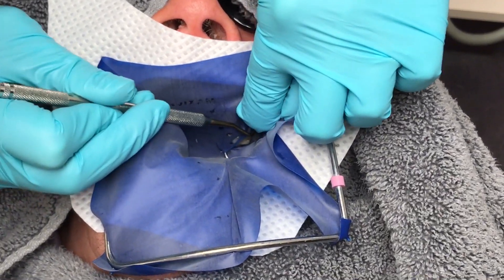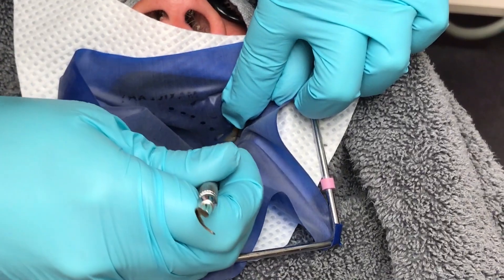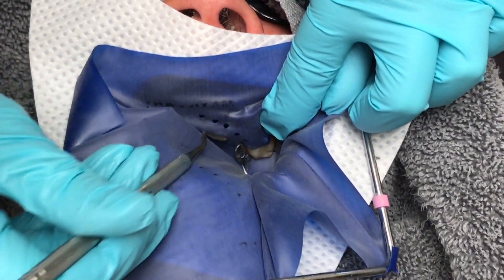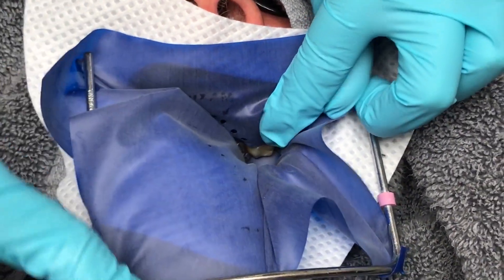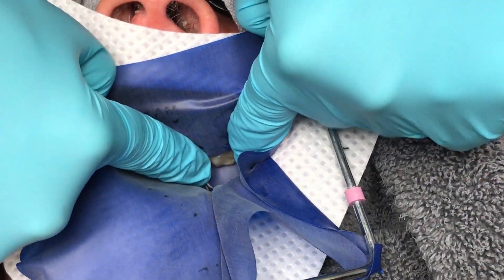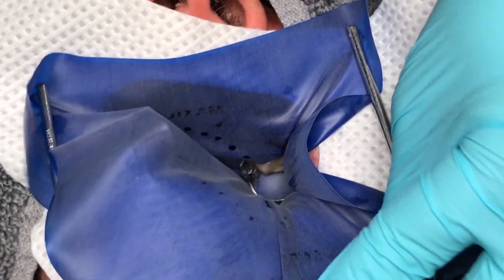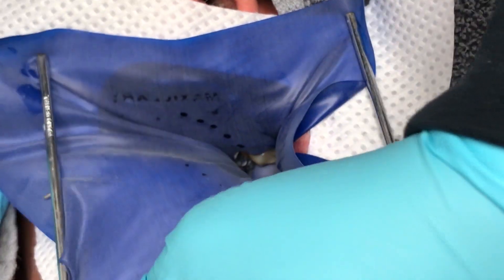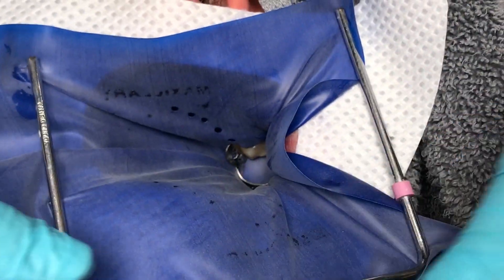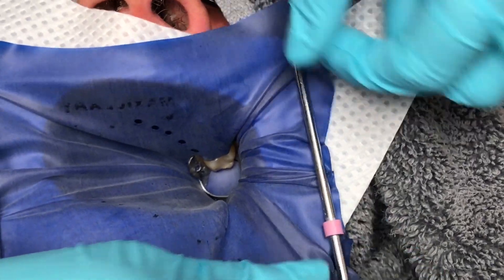A blunt instrument is then needed to drape the dam over the jaws of the clamp. The Clark Curved Sculpting Paddle is the perfect instrument to use because it is blunt and has a curve that makes it very easy to wrap the dam around the jaws of the clamp. I always want to make sure that the clamp is secure, so I press on the jaws one last time, and then the corners and sides of the dam can be pulled tight.